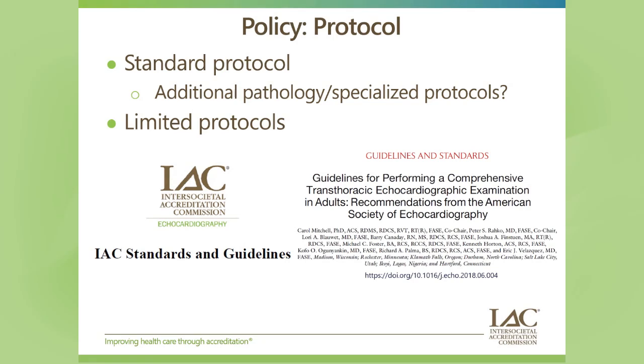Do they need a full everything, or is there a specific question at hand that needs to be answered, and there's not any change in the patient's clinical presentation, so you're able to do something more limited? So we can look at our IAC standards and guidelines for great examples of a standard protocol, and then I've just thrown up one for echo as far as some guidelines and standards for performing transthoracic echoes.